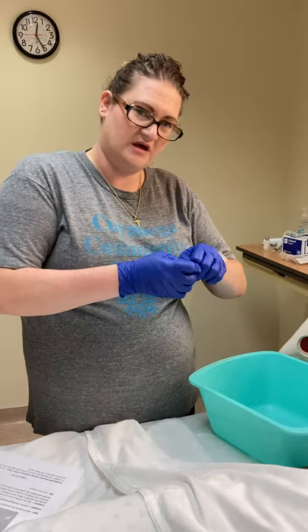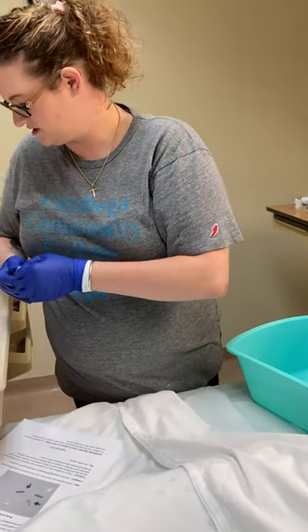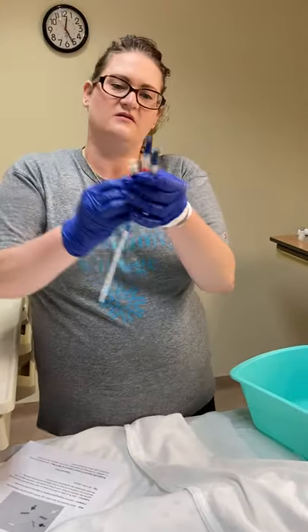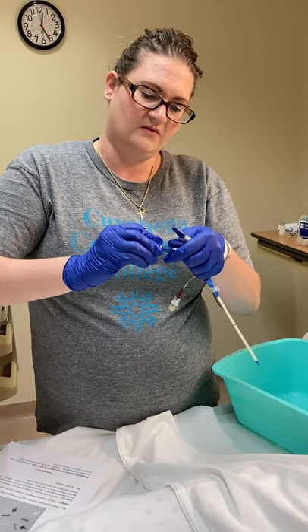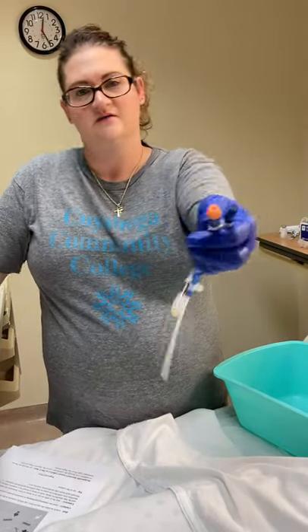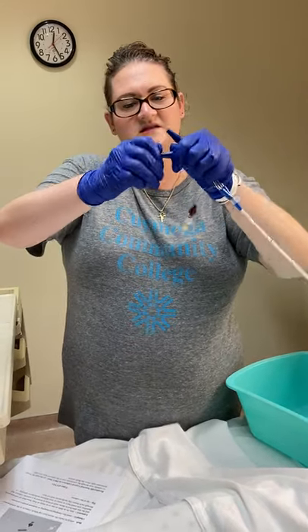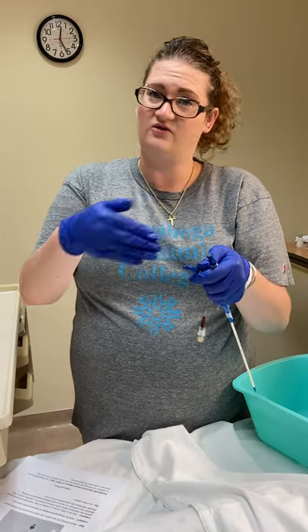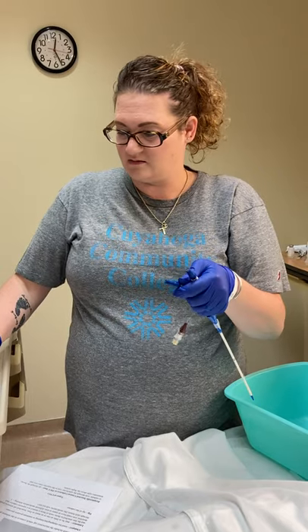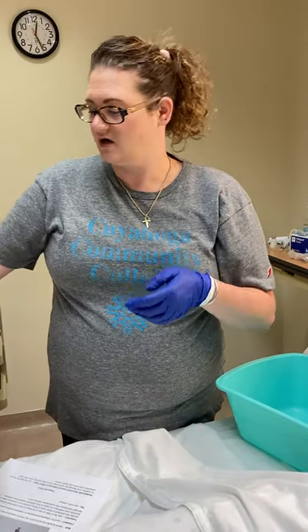Just so you're aware, you may see little caps called Kiro's caps or protective caps on the end of the central lines. These help prevent infection. They sit on the end of the central line, and when you go to access it to give meds, you just take this off. You still have to clean with an alcohol swab for 15 seconds before you access it. You'll probably see these if you have patients with central lines in the hospital — they come in yellow, orange, green, or any kind of variety.